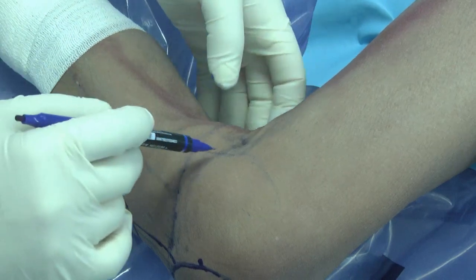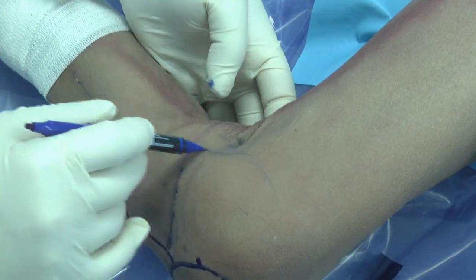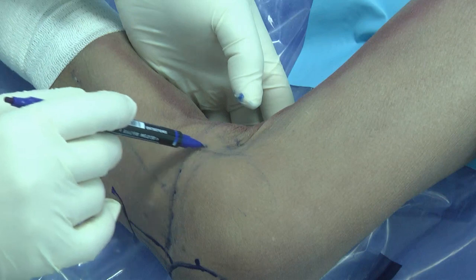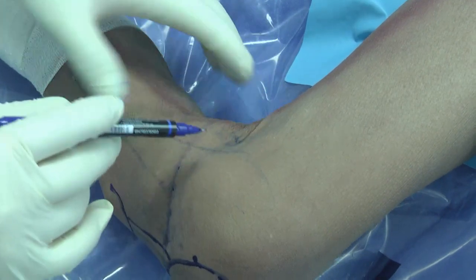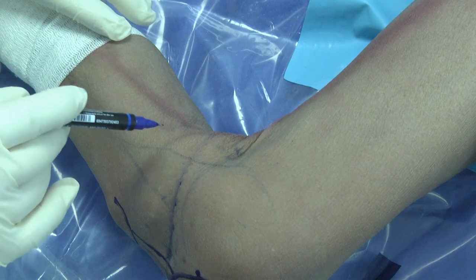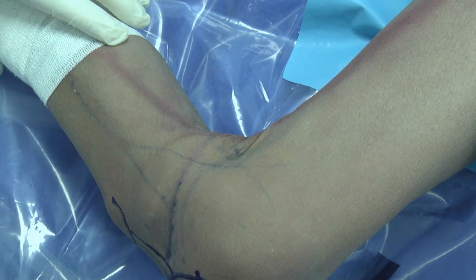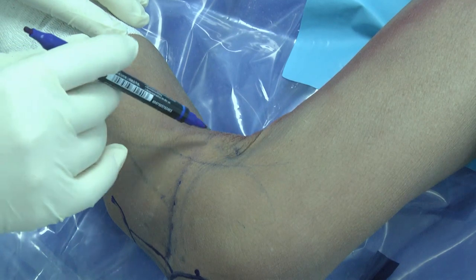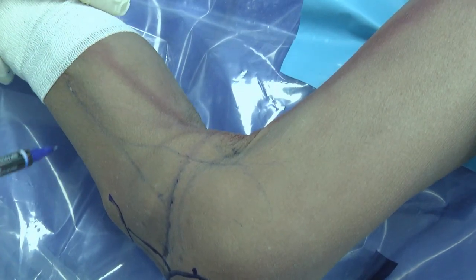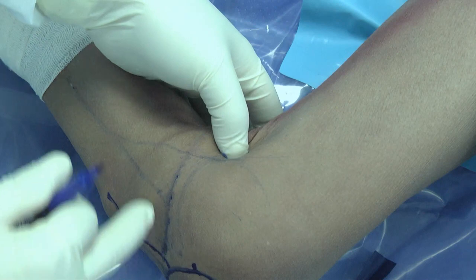You can see this line. And when you make this portal, be careful not to cut these vessels, and also the nerve. So when you go to posterior medial, I recommend you use trans-illumination. Put the scope and light source inside the joint to transilluminate this point. You can see the vessels from the trans-illumination, and you can avoid this injury when you see the vessels, avoiding the saphenous vein and nerve.